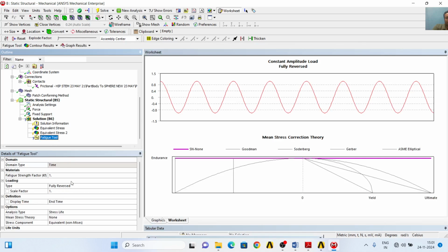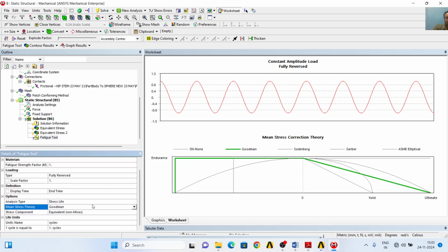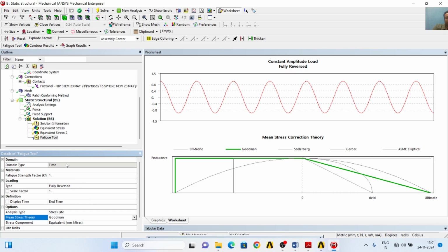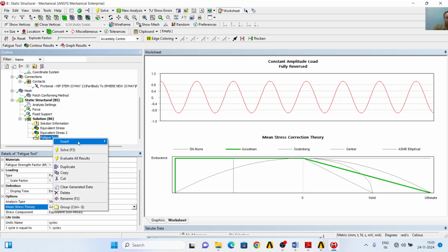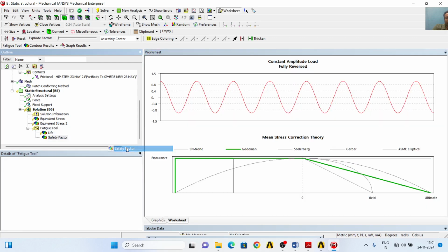I will define its properties now. First of all, analysis type is stress life, with mean stress theory. I will use the Goodman mean stress fatigue theory. Okay, with loading type fully reversed, scale factor 1, and stress life equivalent stress. One cycle is equal to one cycle. Now I will insert life and insert safety factor.